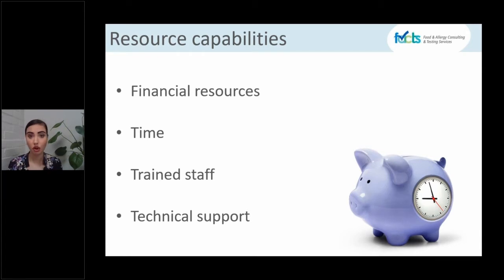Rapid kits are quick to perform, but you need to think about the timing. Each kit requires a different amount of time to perform the test. Very importantly, if you are under pressure, you can't say it takes too long to perform the test and just start with the production again. Especially with these kits, there is a set period of time you need to wait, and if you read the results before that specified time, it might give you unreliable or inaccurate results. So timing is very important to look at, to make sure that you get a kit that fits into your schedule.